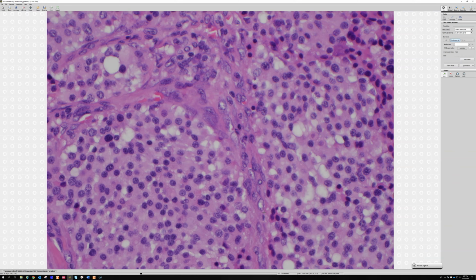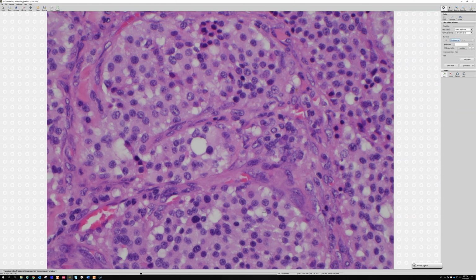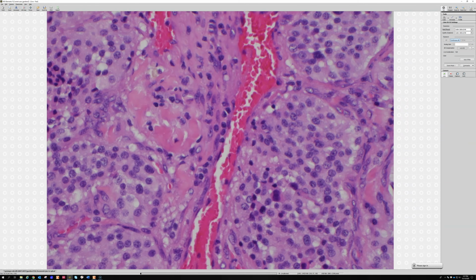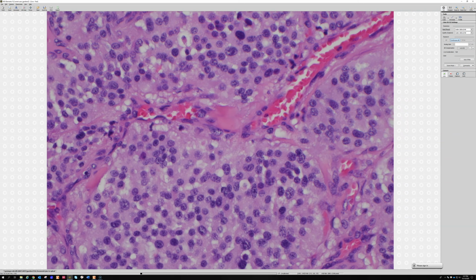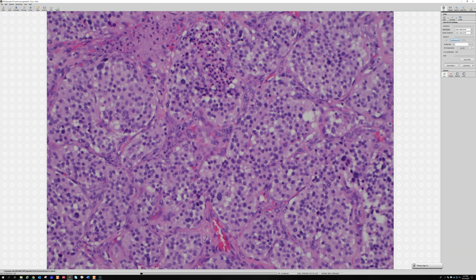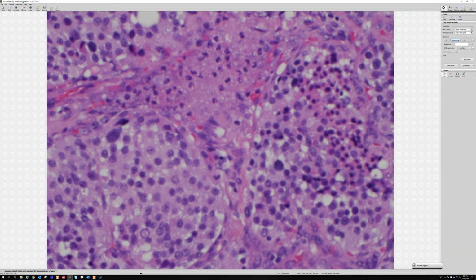And like with other neuroendocrine tumors, you oftentimes will have random pleomorphism, random large nuclei scattered in the midst of this. So that's a very helpful feature, that it has that neuroendocrine look with the nice stippled chromatin and the random atypical cells. Okay, and then if you needed to do stains, what immunostains would you want to do here?